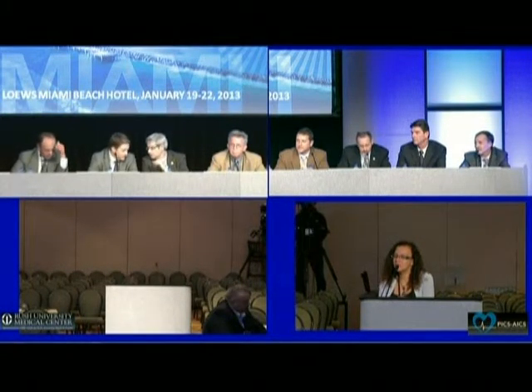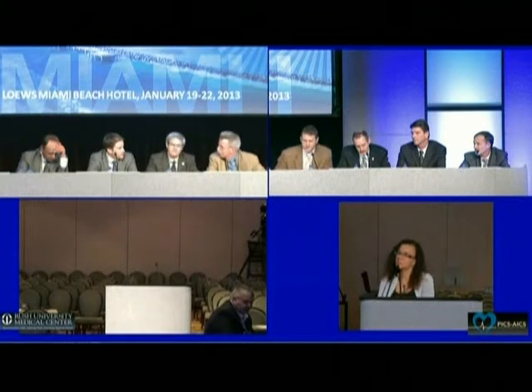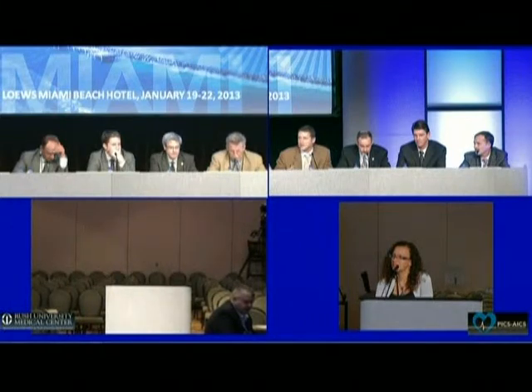And what doses are you using? I guess we're really new to this, and I know there's a learning curve. This is for how much light contrast and the dilution? It turns out, like everything else, as you get more experience with it, you get a little better at it, but it's become rare to be higher than 1 cc per kilo. And as Lee showed, we all do this differently, I think. There are various recipes, but they mostly all involve diluting the contrast either 1-to-1 or 2-to-1, depending on the structure.